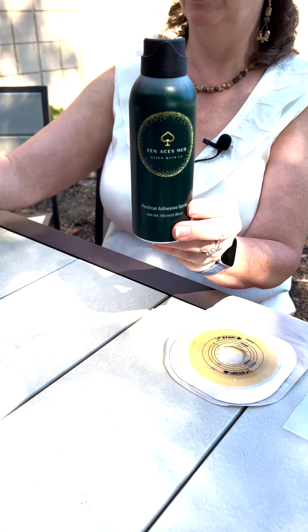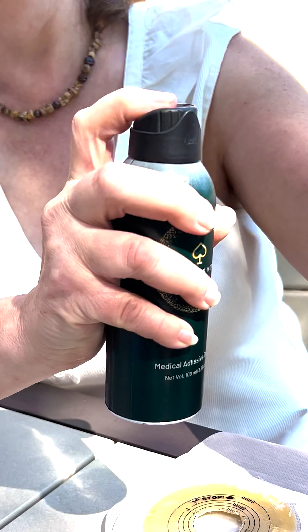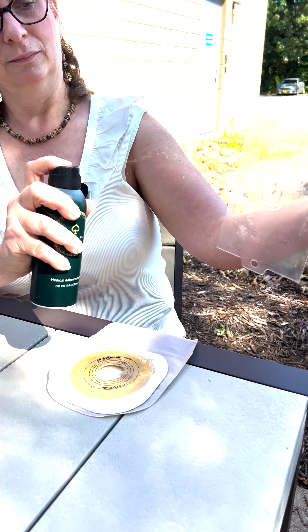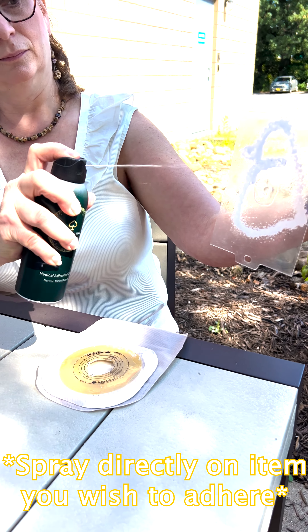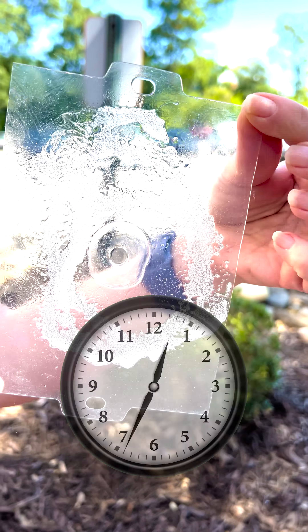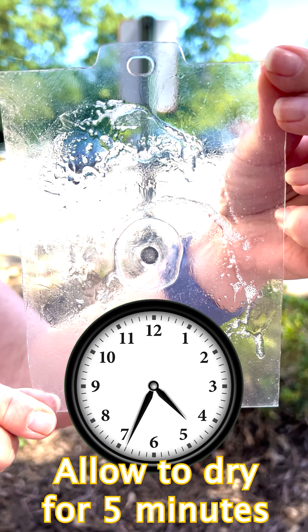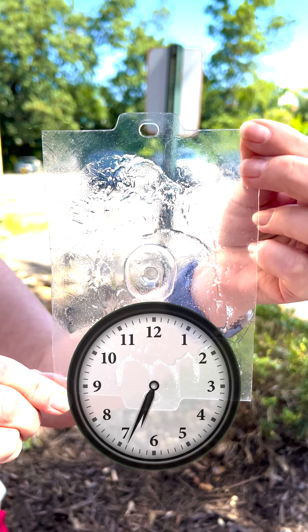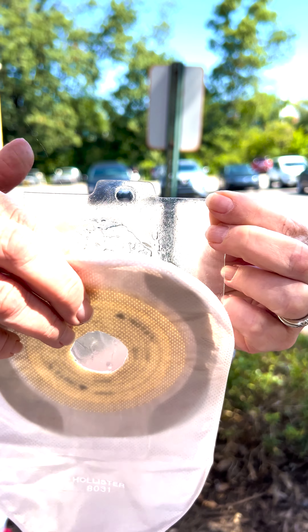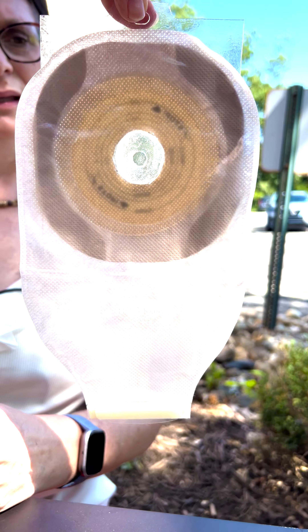Let me show you how it works. Great packaging. Twist to open. Give it a shake. Spray on. Let it dry. Stick it on. Spray, dry, and stick.